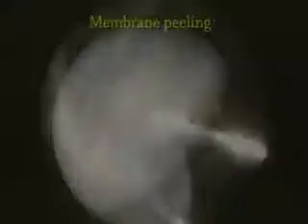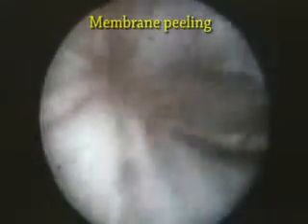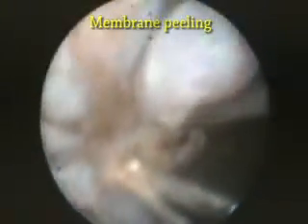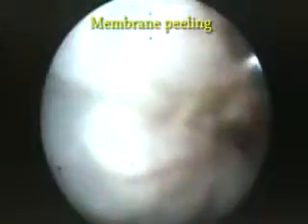Endoscopy also offers multiple direct planes of view to reveal how anterior PVR is creating traction, instead of the artificially contorted view seen through a microscope with scleral depression. Again, limited field of view and lack of stereopsis make this maneuvering challenging. Endoscopy can be maneuvered to do retinectomy as seen here. However, the orientation and the direction of movement of the cutter to execute retinectomy is quite difficult.